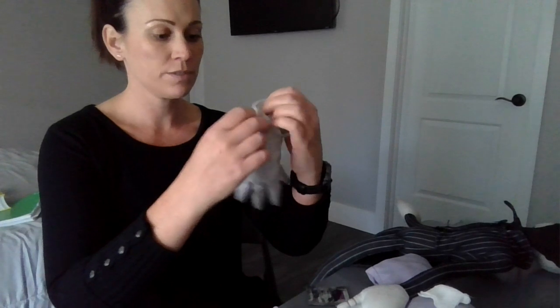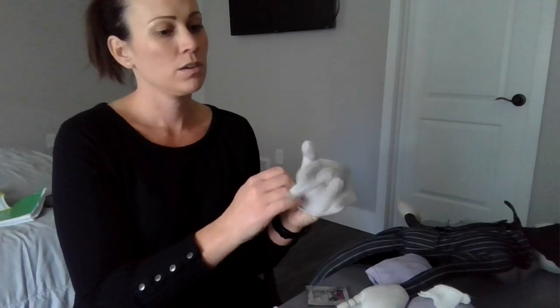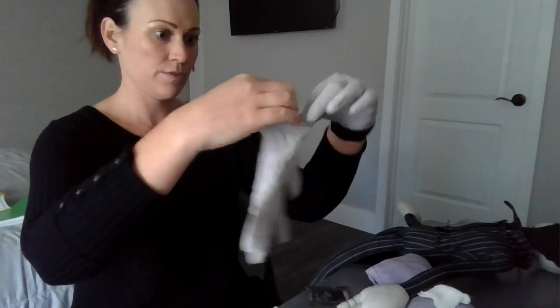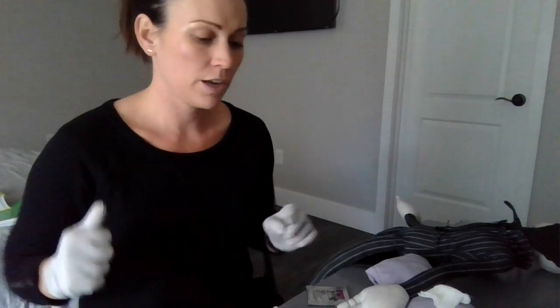The first thing I would do is perform an Allen's test just to make sure that we have good collateral return for the blood draw to be done on the radial artery. I probably would have done the standard precautions before I even did the Allen's test, so that I had my gloves and everything on — so after I've done all that, I'll go ahead and wash my hands and put on standard precautions.